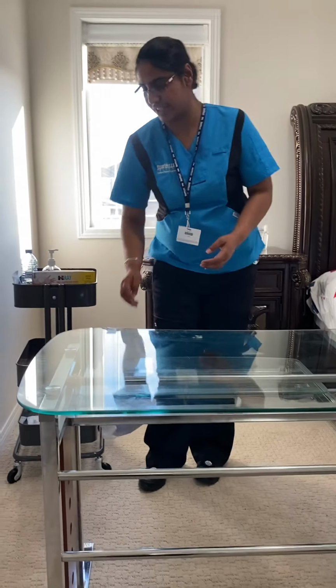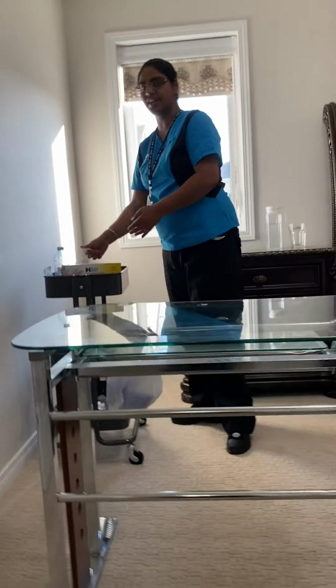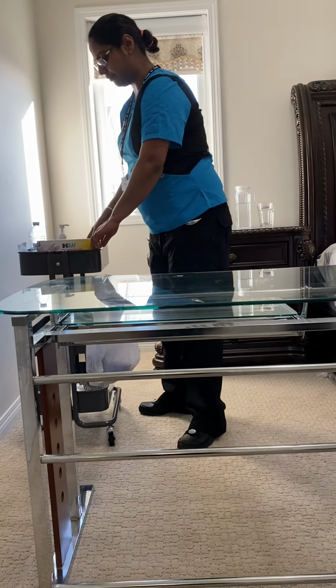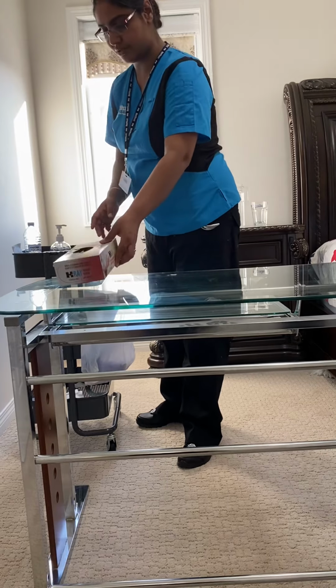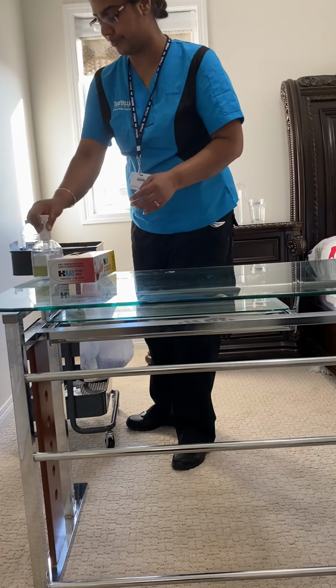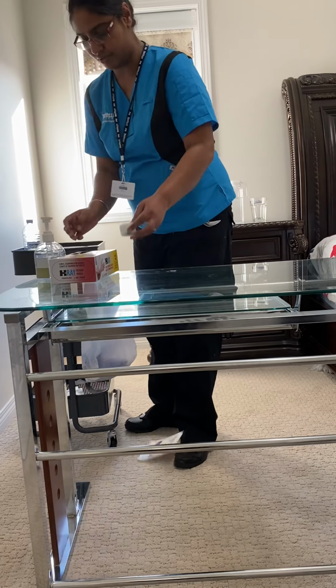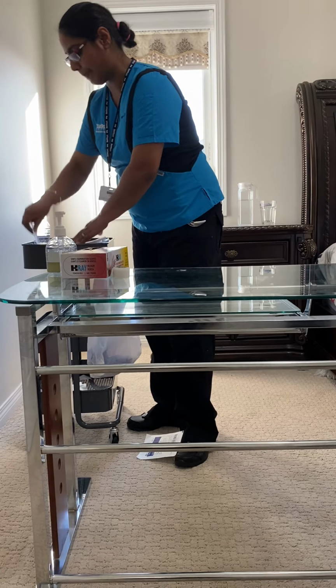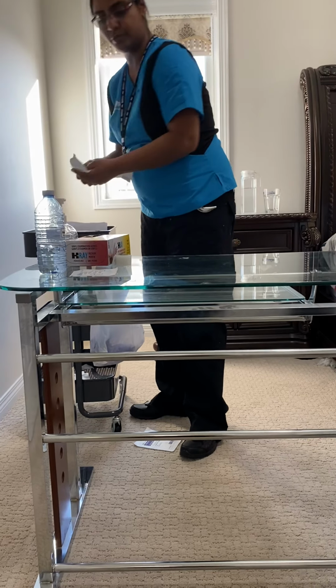Put it in the garbage. Again, hand hygiene for 30 seconds. Now my table is ready for the sterile field. Now I'm putting some supplies. This is my gloves, and my hand sanitizer and tape and some extra gauze pieces and normal saline, my staple removal kit.